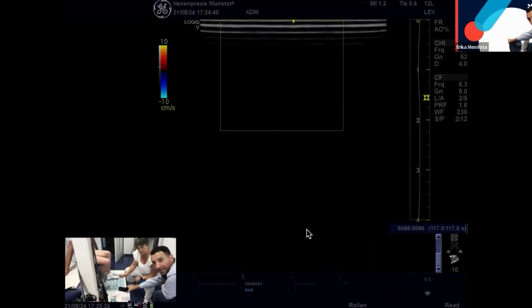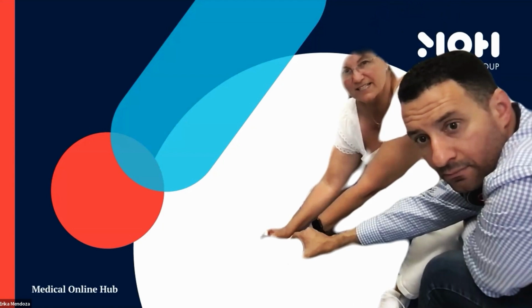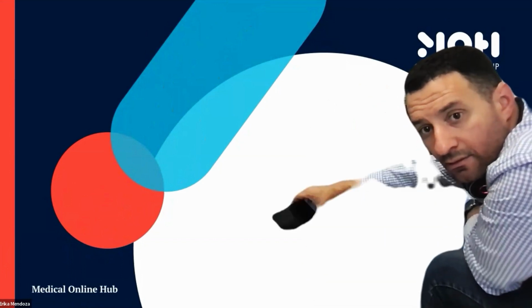Maybe you can stop sharing the screen and then put one. Okay, perfect. Now it is better, yes? Now it's better, but it's not a single image. If you can make it larger. I make it together, so it will be better understandable.